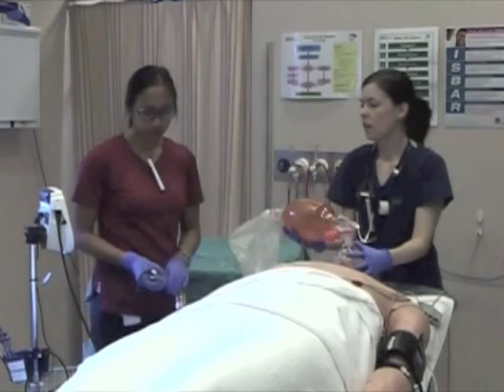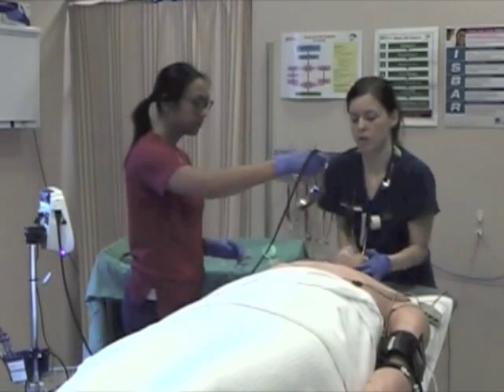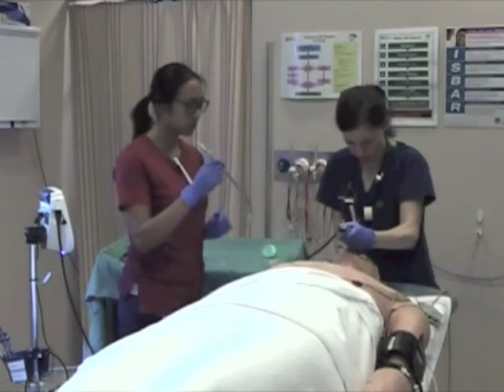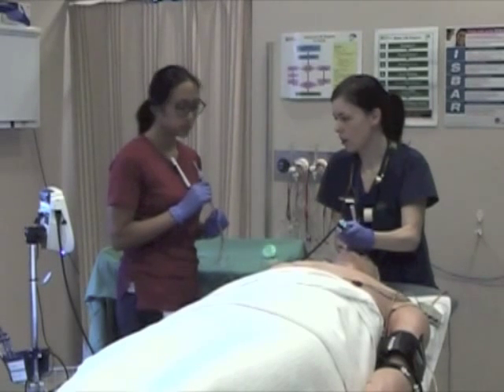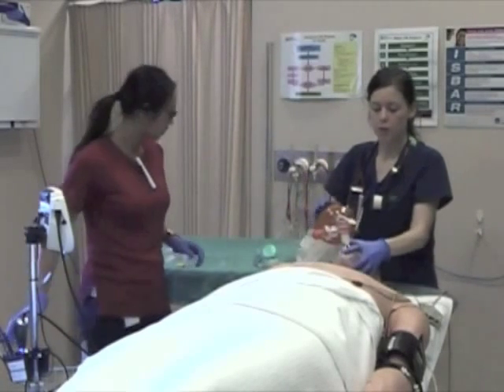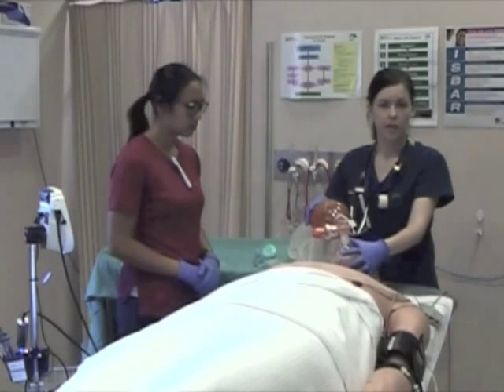Good. So Jenny, if I can get the MAC blade and the tube ready? Yep, great, ready to go. Good. We're just going down the back of the tongue. I see some epiglottis. I'm looking up to the video and it's still a poor view. Okay, we're going to come back out and reassume our stance. So we're going to move to Airway Plan B. We're going to optimise his airway and also use some laryngeal manoeuvres.